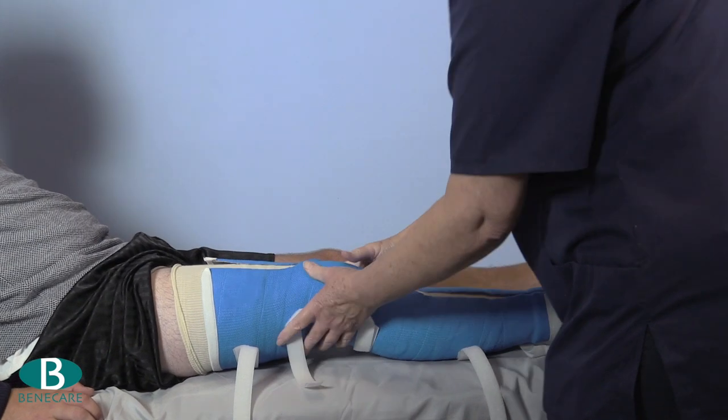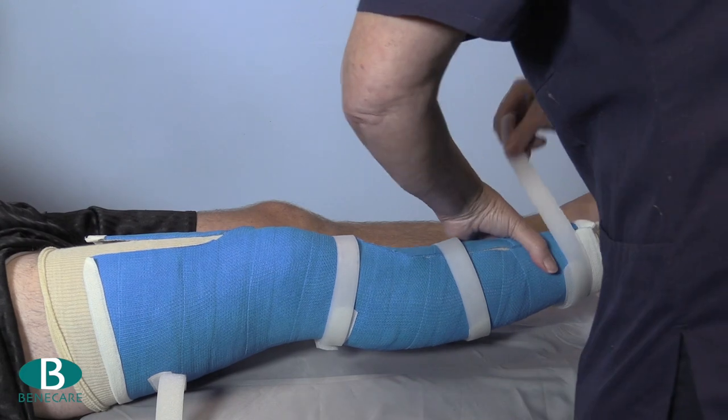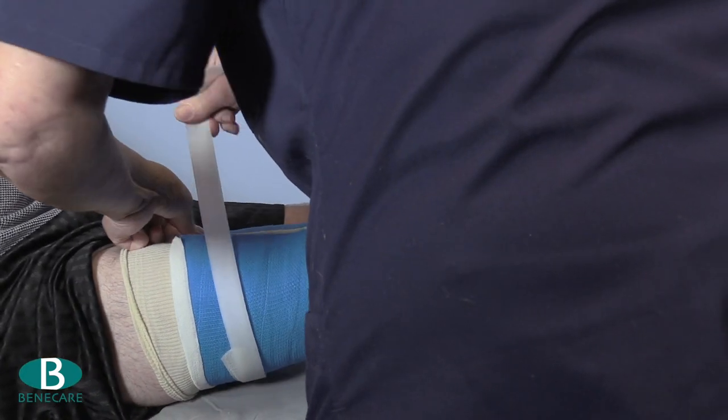Re-apply the cast to the limb. Ensure it is a good fit, providing excellent compression and support, and that it is functional and the patient feels comfortable.